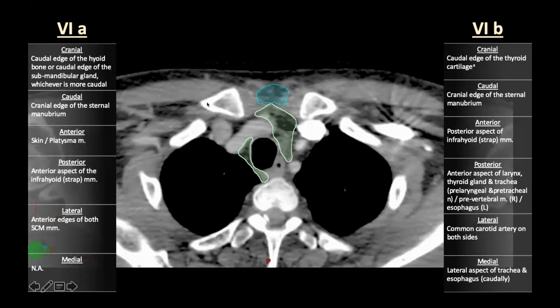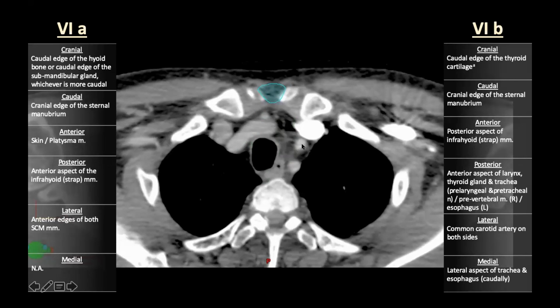Yeah, so this is not clear, the upper and the lower, and also bulky and non-bulky. There's no clear guideline mentioned anywhere. Unless you have very bulky disease, especially probably close to your first cervical or the second cervical vertebra, maybe it makes sense to delineate cranially. But there's no clear definition given anywhere, even for bulky as well as for cranial.